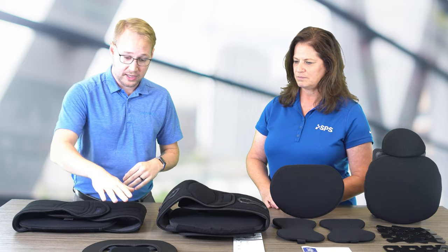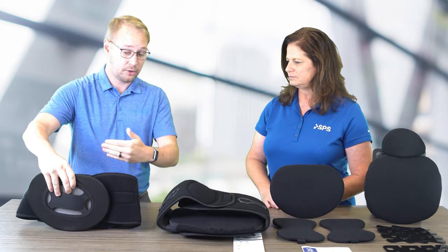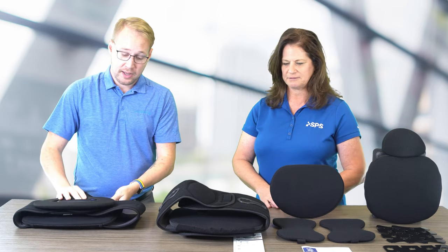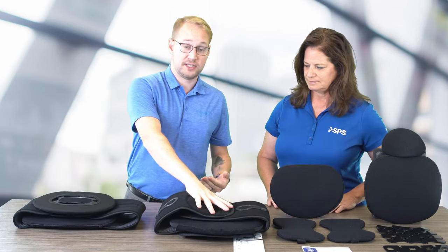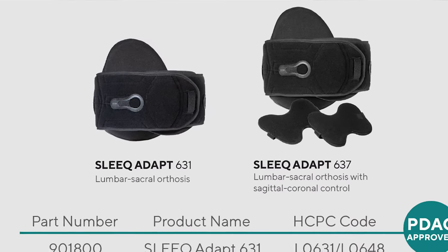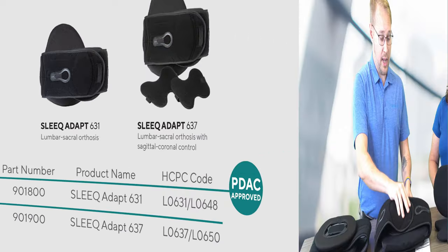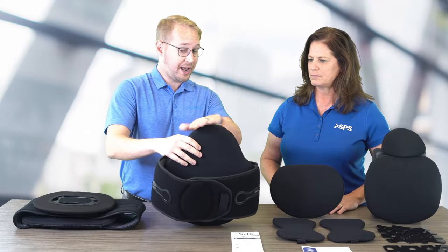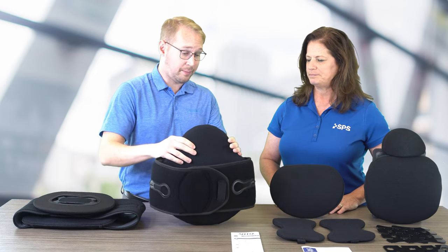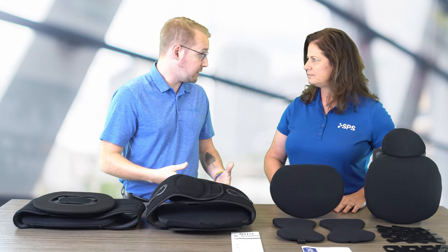So we do have the anterior panel that fits onto that right here, which provides that anterior-posterior support. As you move up into the Sleek Adapt, this is where we start getting into the LSO — that's going to be your L0637 code. And you can see that we have that posterior support in the back, and then we have different additions to provide more rigidity to that.